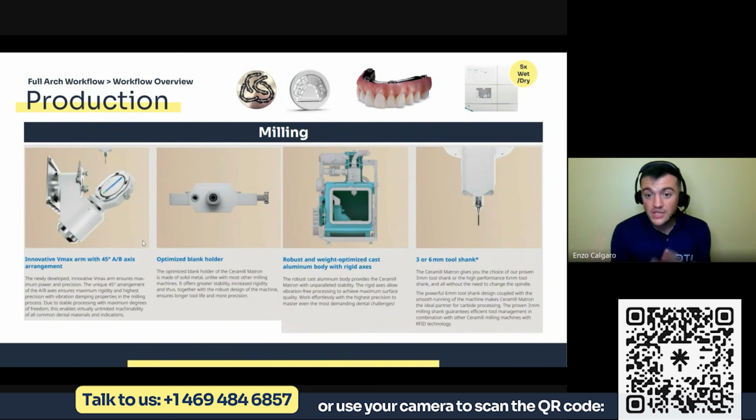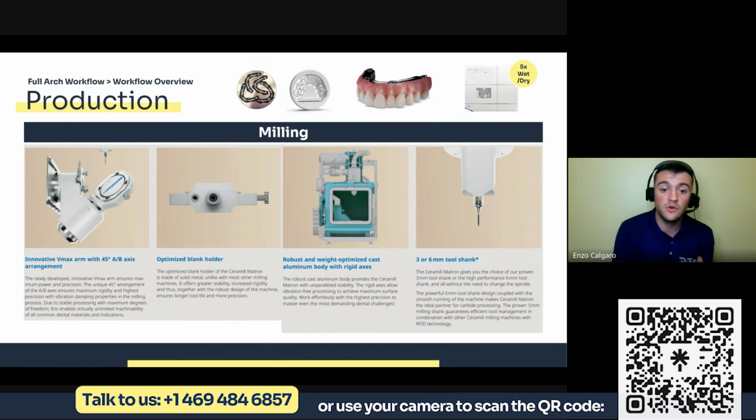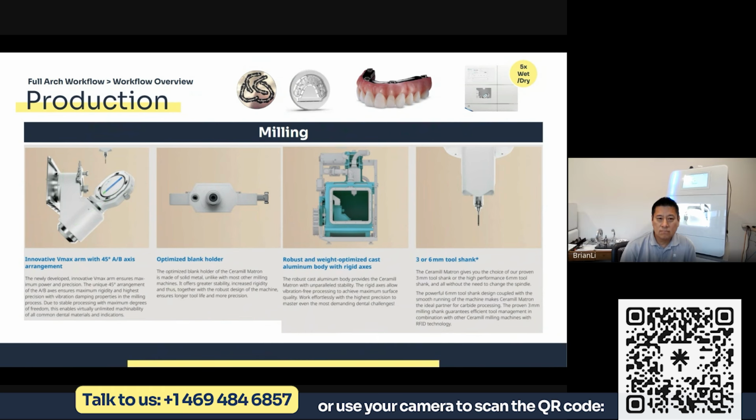So the Matron would be the perfect choice inside the Amann Girrbach portfolio. Why? Because it was honestly built for that. I can spend another hour just talking about the technicalities of what makes the Matron the perfect mill for metal, but I just chose 4 items here. Number one is this VMAX arm. VMAX because it's in a V shape. Basically, what this does, it gives stiffness during the milling process.